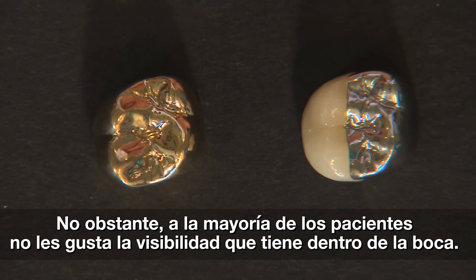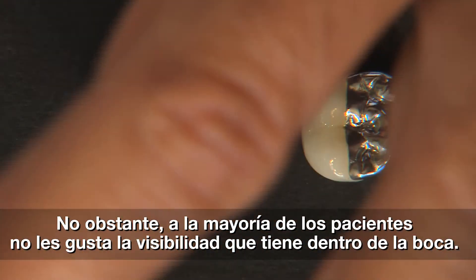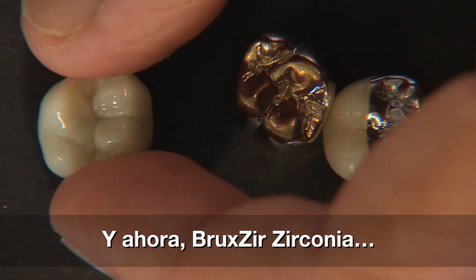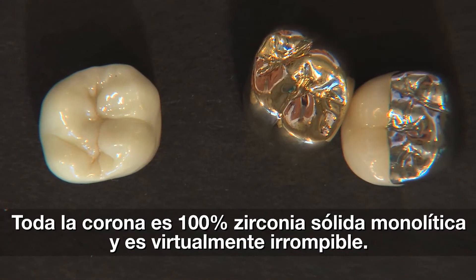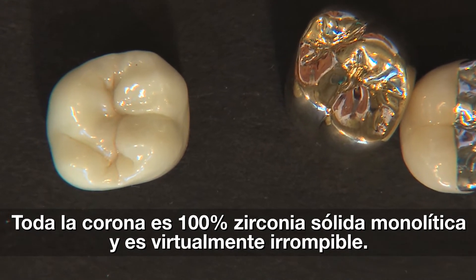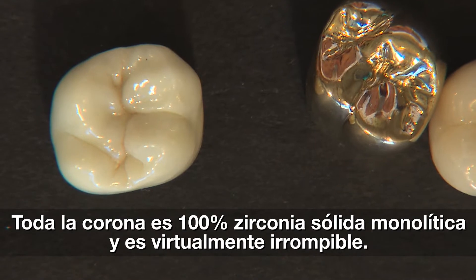So these two choices aren't seen as aesthetically favorable for the patient. Enter BruxZir. Let's take a look at how BruxZir fits into all of this. And again, this is a 100% zirconia-based crown. So there's no porcelain on this crown — it's entirely zirconia.